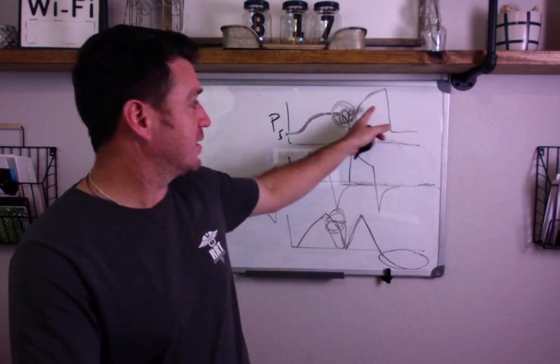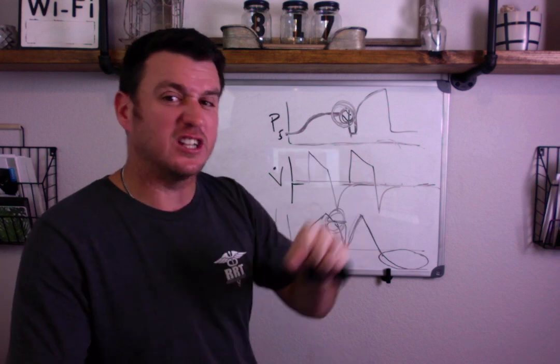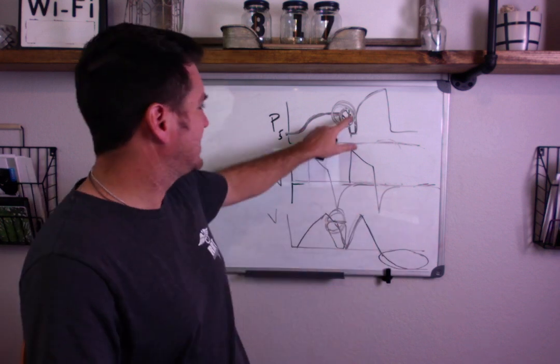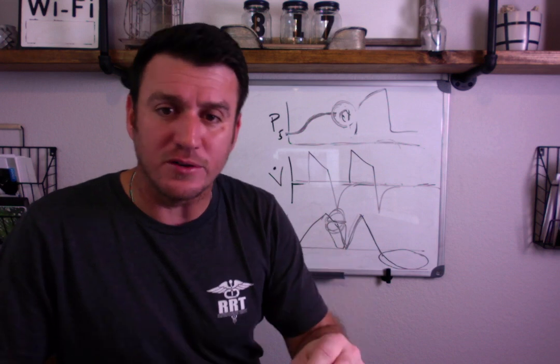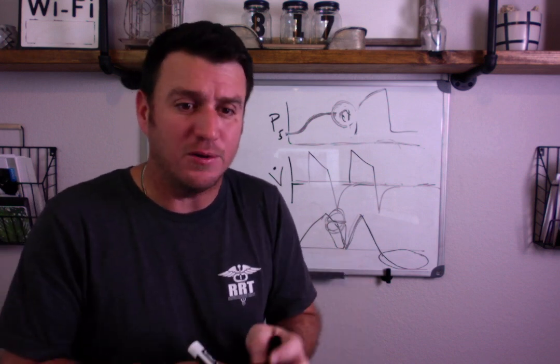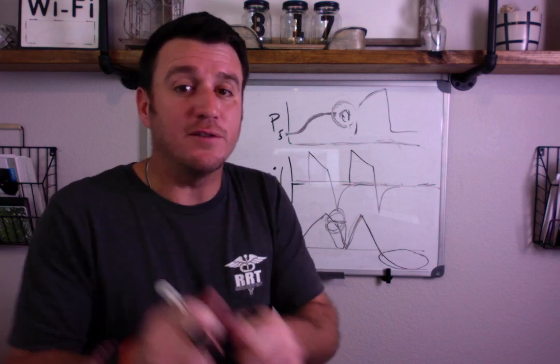Because what you're going to do here is you're going to go in and you're going to do one of two things. Either you're going to troubleshoot and go, I think the patient wants more volume because they got this late drop in pressure, which is initiating the next breath, and I think they're volume hungry. So let's try turning up the volume a little bit, and you're going to find that just a few more cc's of volume solves this.